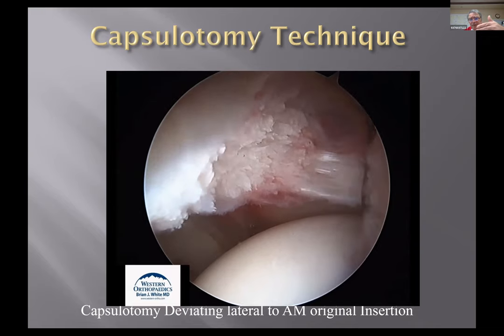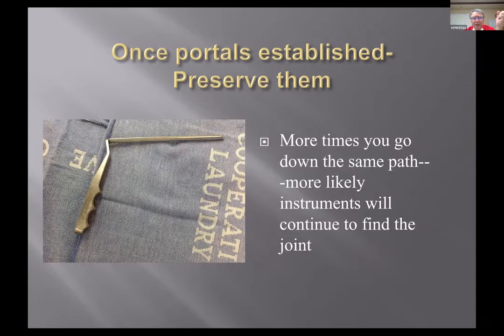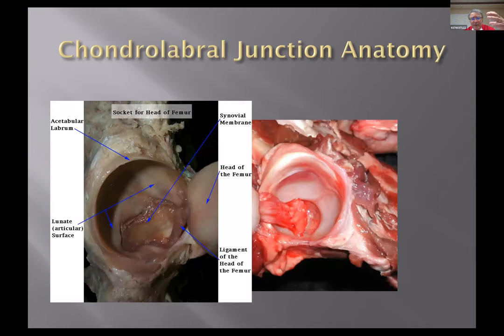Some of us do T capsulotomies. I don't do a lot of those because unless I have to get way down on the neck, a lot of times my sutures can do that for me. Once you have your portals established, if you have a curved instrument or a larger instrument than normal, like a pick, you can use a half pipe or a switching thing called a sled. And then that lets you see this chondrolabral area.